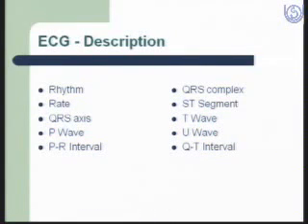So whenever we get an ECG, how do we describe an ECG? It is always better, whenever you see an ECG, to see it systematically so that you don't miss anything and reach a proper diagnosis. ECG is highly valuable not only in cardiology practice, but even otherwise. If you are a surgeon, you may get a patient who has certain heart disease, and during pre-anesthetic checkup you find that he has some abnormality in the ECG.